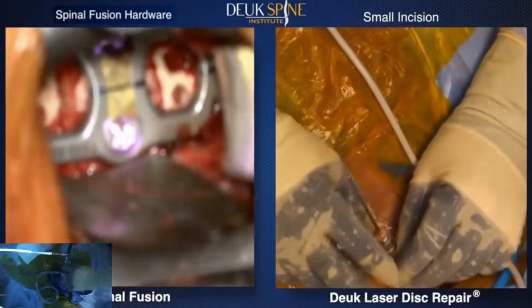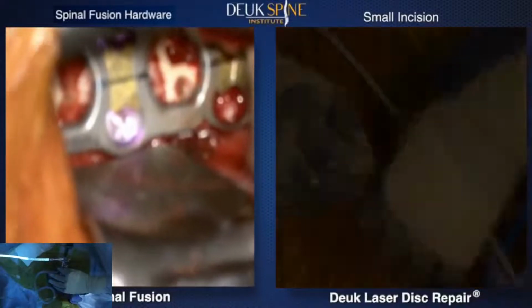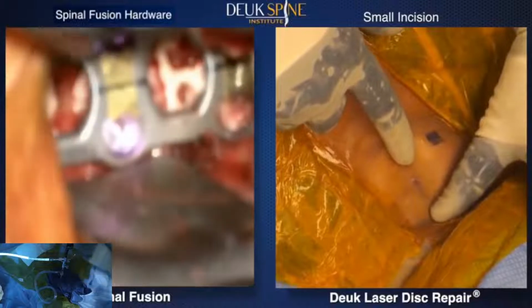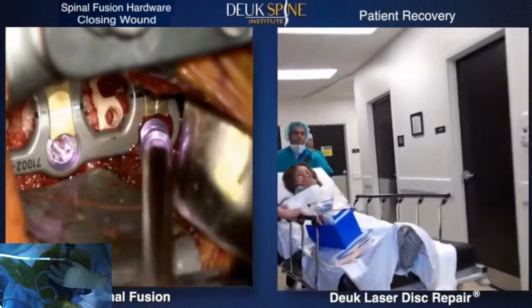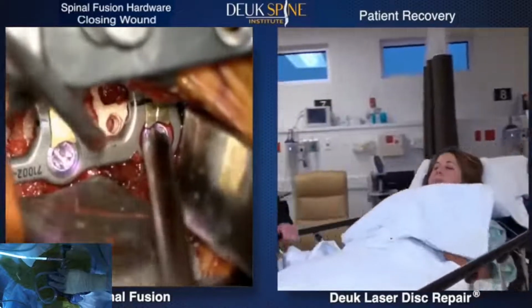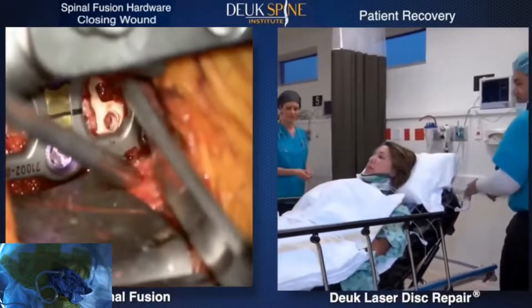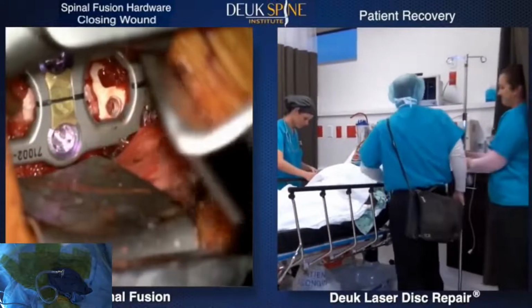Once the laser has removed the painful part of the annular tear, the endoscope and tubular retractor are removed, leaving less than 1/2 inch incision in the skin, which is closed with a single stitch, Steri-strips, and a Band-Aid. Total time for the Deuk laser disc repair surgery, approximately 1 hour. The fusion, however, is still underway. Holes in the spine must be tapped in preparation for the large screws that anchor the fusion hardware. The Deuk laser disc repair patient is in recovery usually 45 to 60 minutes before released to go home.